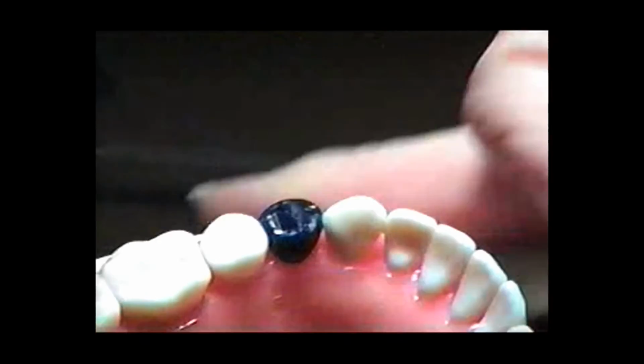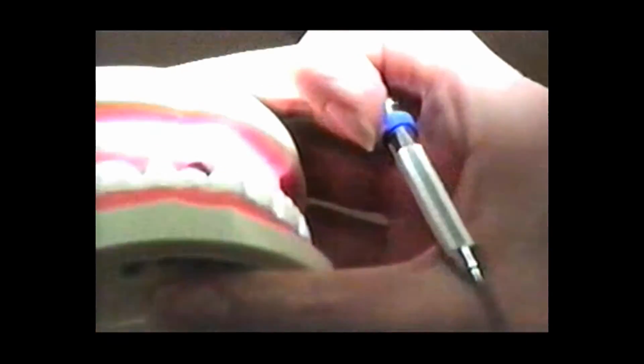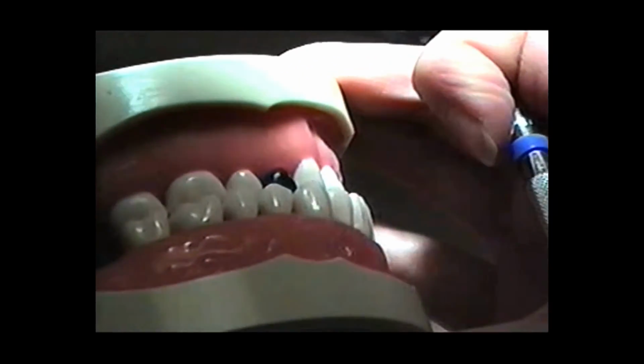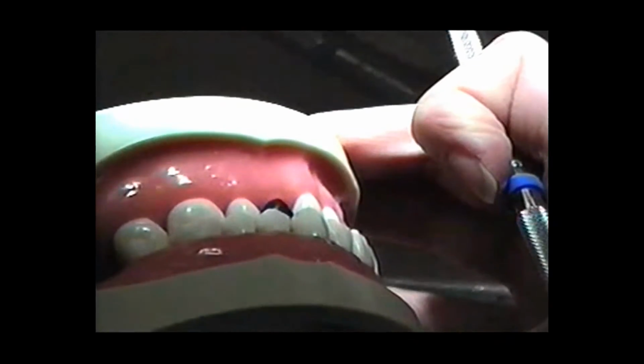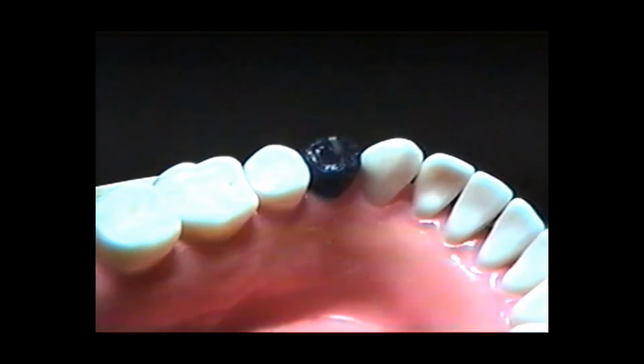Now what I'd like to do is just double check and see where my occlusion's at, because I don't want to make this high. So let me just squeeze it together a little bit. That's what you would do. Just go ahead, squeeze it together. See if you get any little dents on the occlusal surface. If you do, then you've got a little too much wax.